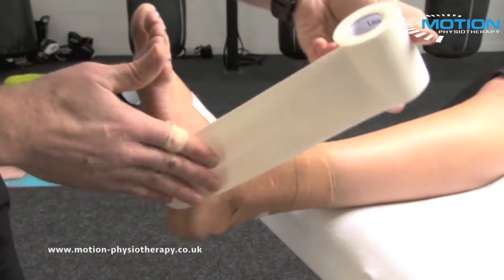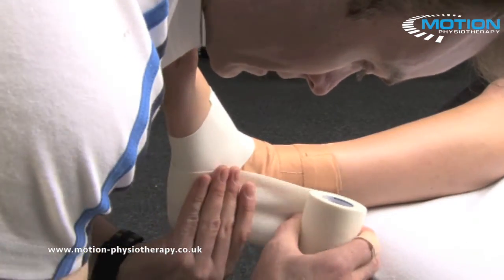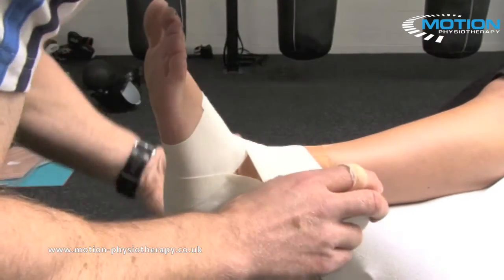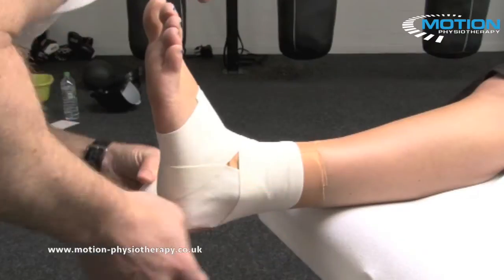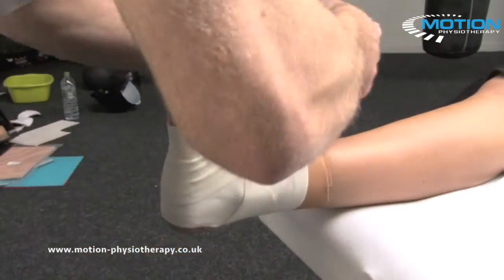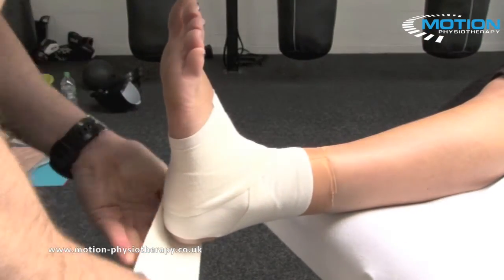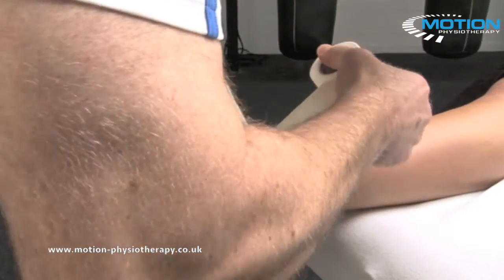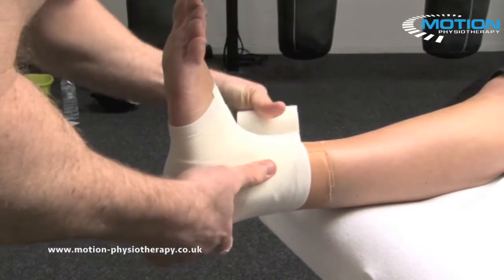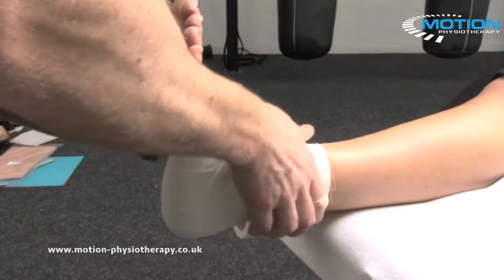Applying light tension through this tape, asking your patient to stay at 90 degrees. Hook around the back, go around the joint once, and back down across the Achilles, hooking underneath the foot, keeping that foot at 90. Then hook and take in the heel bone, flattening as you go so we're having no creases. And that's that technique finished.